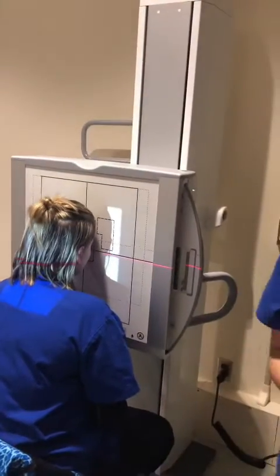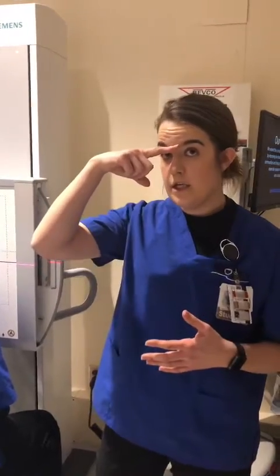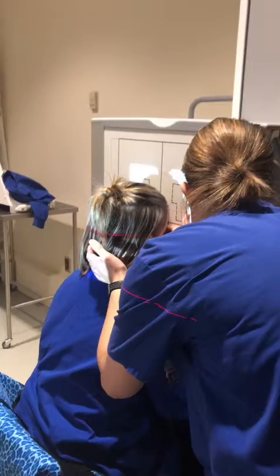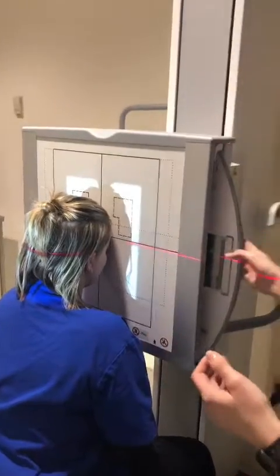I have a 10 by 12 portrait, so I just want to make sure that I have all of the top of the skull, all of the sides, and all of the soft tissue, and that I'm not cutting off anything. So I'm going to ensure that your central ray exits at your glabella right here, the bridge of your nose. So I'm going to make sure that is centered and that is lined up.